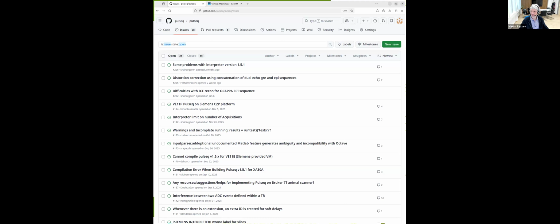The best thing in my experience is just to wait a minute. You can see the screen if you can look into the magnet from your working place, or these tablets on the sides of the magnet, or on some other models on the top of the magnet, where you see that it goes black and then some kind of booting sequence shows up. After a minute or so, all our scanners recover. They show again the normal table control or coil selection interface.